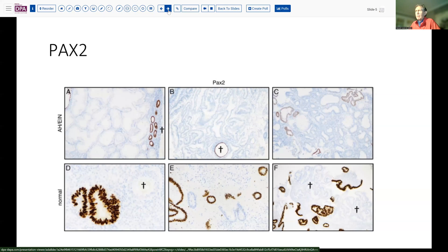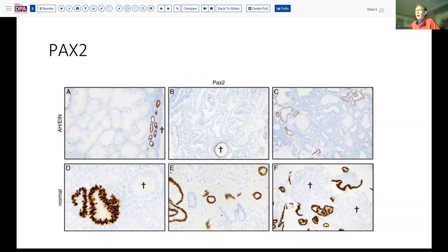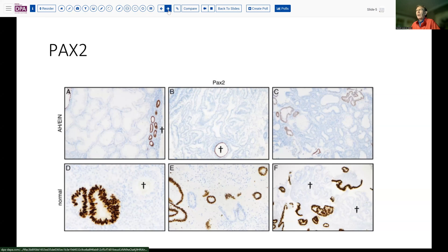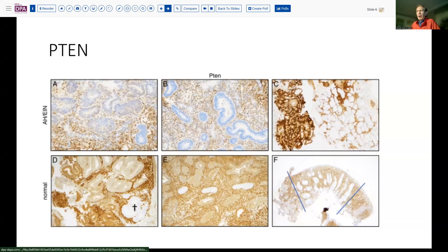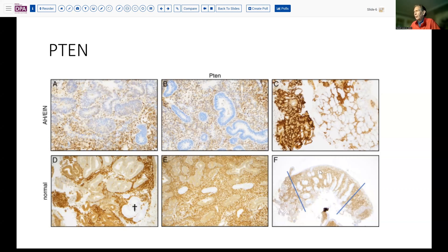Here is some demonstration of findings using PAX2 in atypical hyperplasia versus normal. While occasional glands may lose PAX2, most will be strongly positive. Here you see a couple of others compared to areas of atypical hyperplasia, which may have some residual normal glands that retain PAX2 activity but show evidence of loss of this marker. Similarly with PTEN, you can compare the normal findings — with sort of weak pale cytoplasmic staining and stromal positive staining — to complete loss in the glandular structures. Notice, however, that occasionally there are small zones in normal endometria where PTEN can be lost, which may be pertinent to our current case.